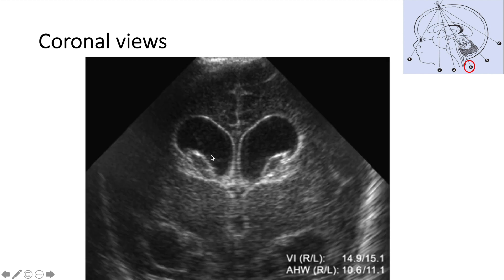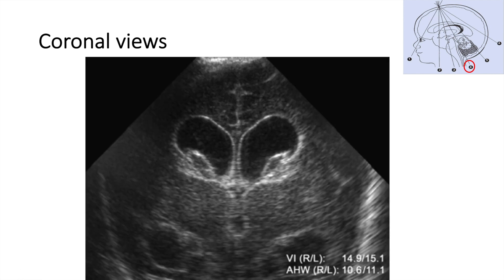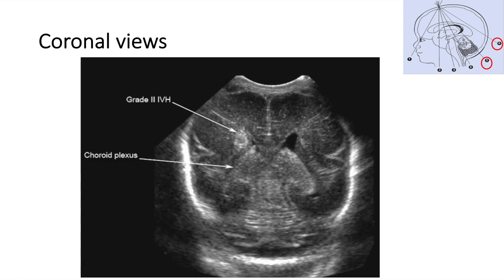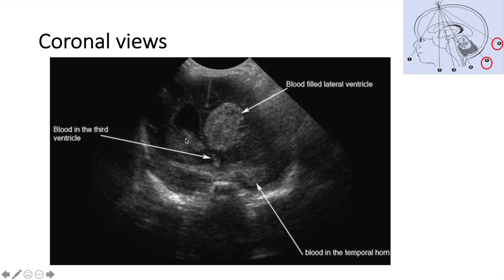This is an example of dilated ventricles on the coronal view. Moving backward, you see the body of the lateral ventricle on each side, with the bright choroid plexus inside it. This is grade two IVH when you see bright clot extending inside the ventricle. This is more blood, and this is grade three IVH.